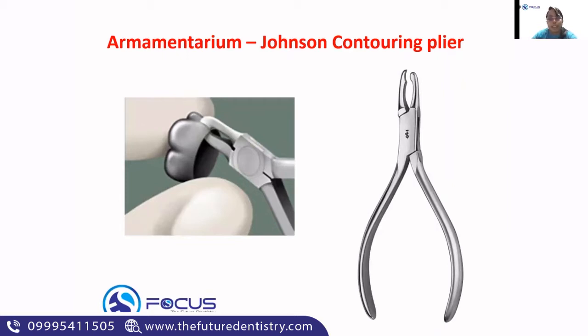When you're doing a band adaptation, you don't generally require a Johnson's contouring plier. But when you're working with a preformed or ready-made band, you need a Johnson's contouring plier to give the proper contouring around the tooth. So this is the picture of a Johnson's contouring plier. It is the same plier that we use as a contouring plier in fabrication of a stainless steel crown.